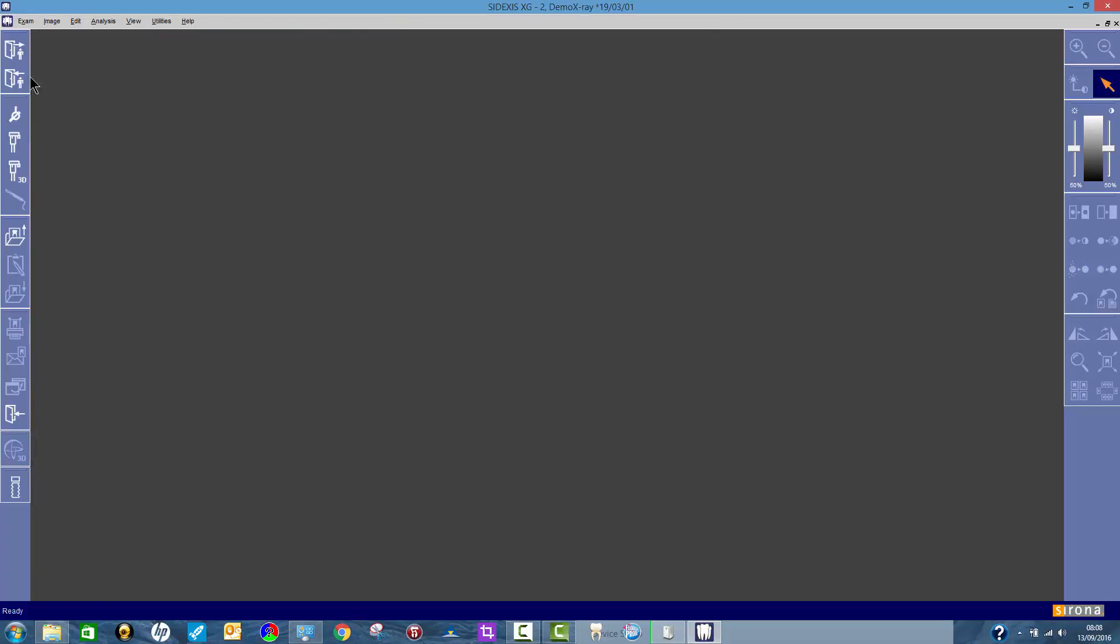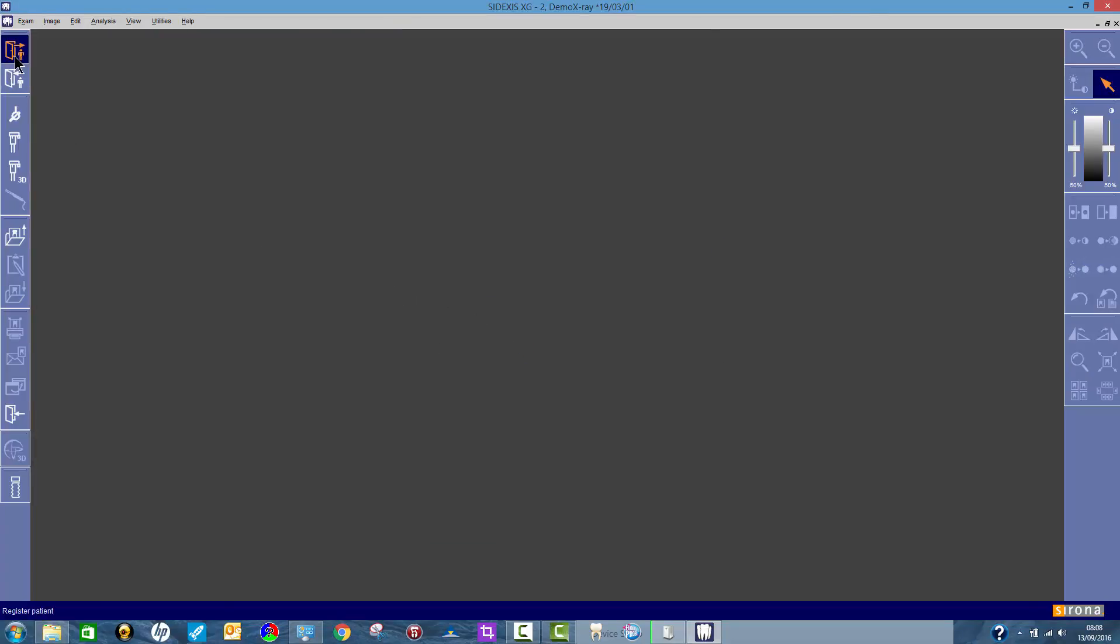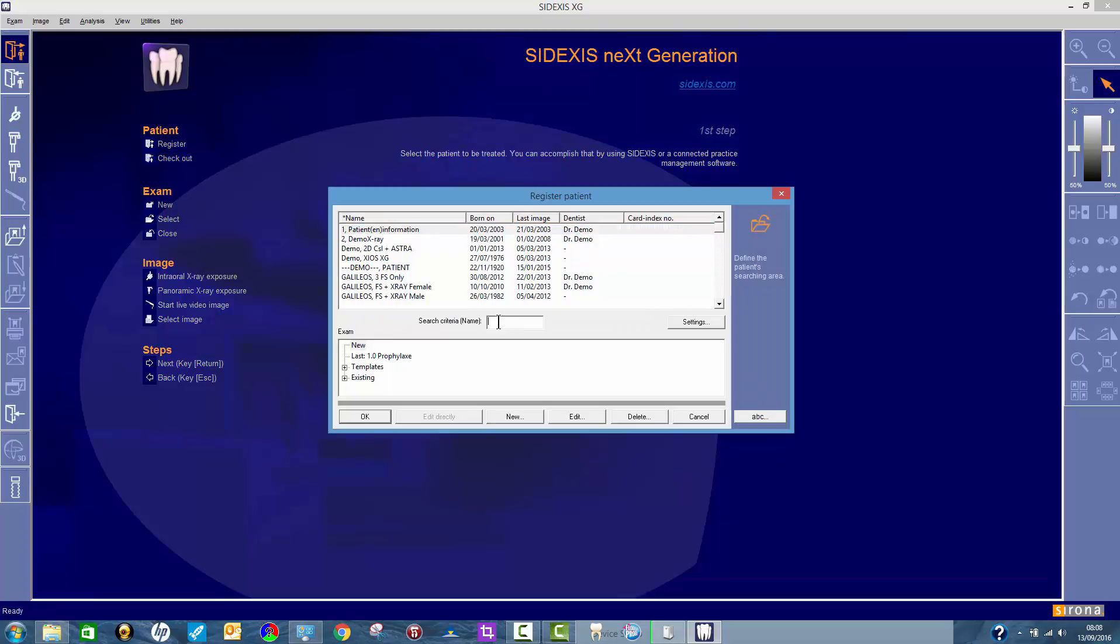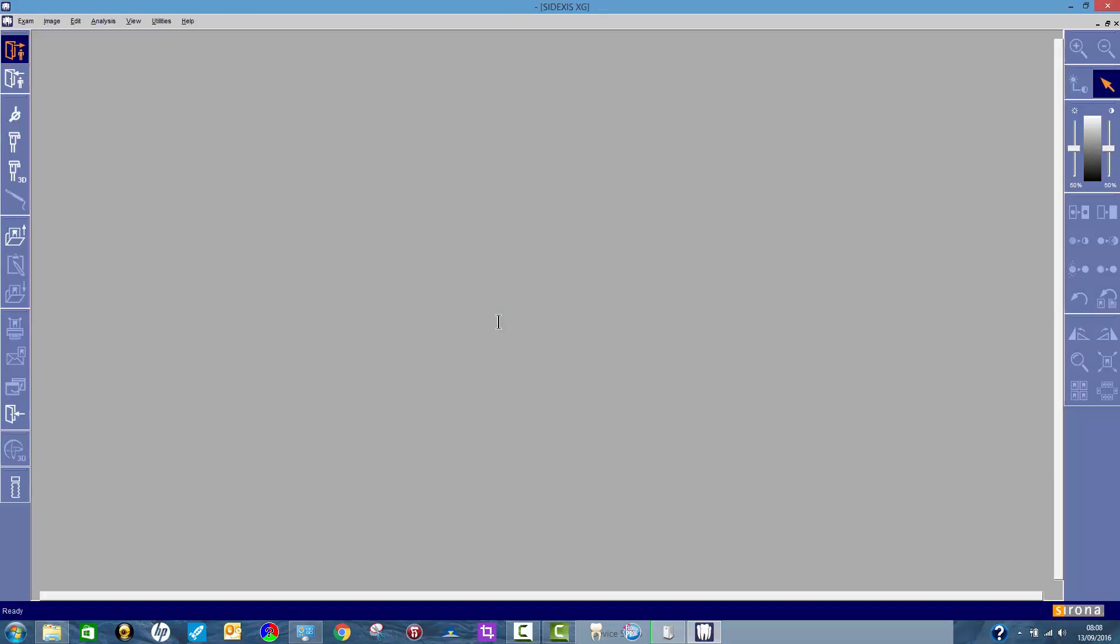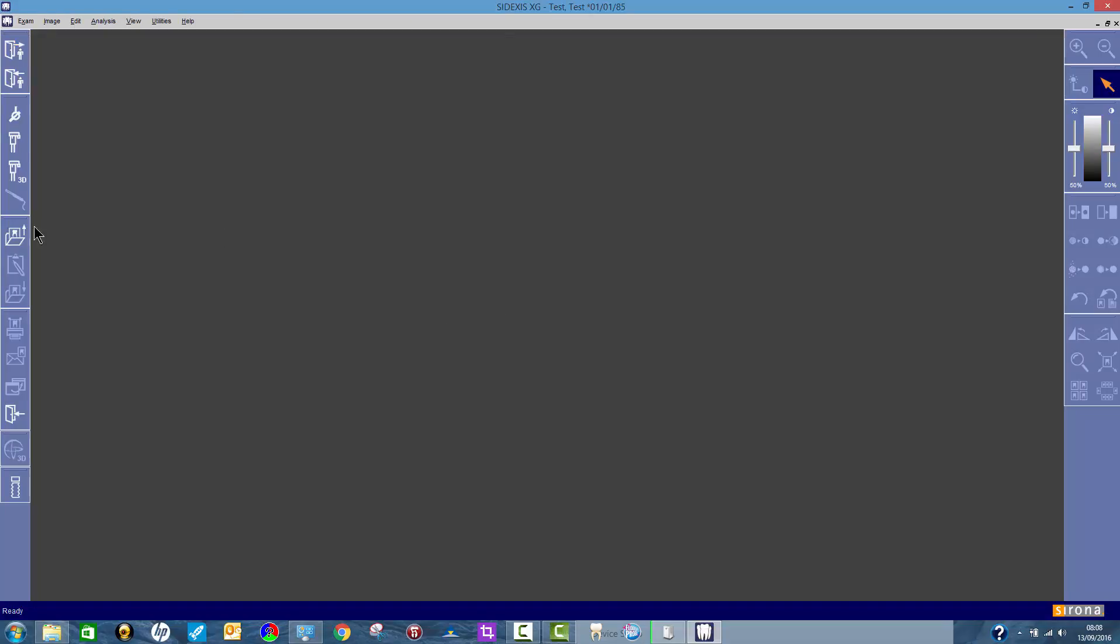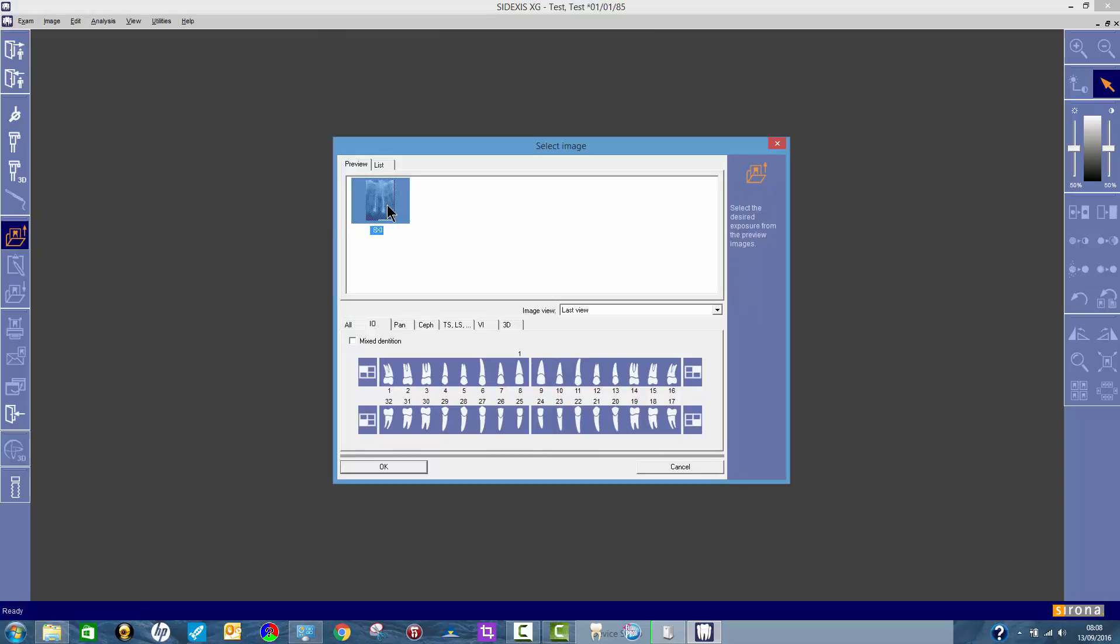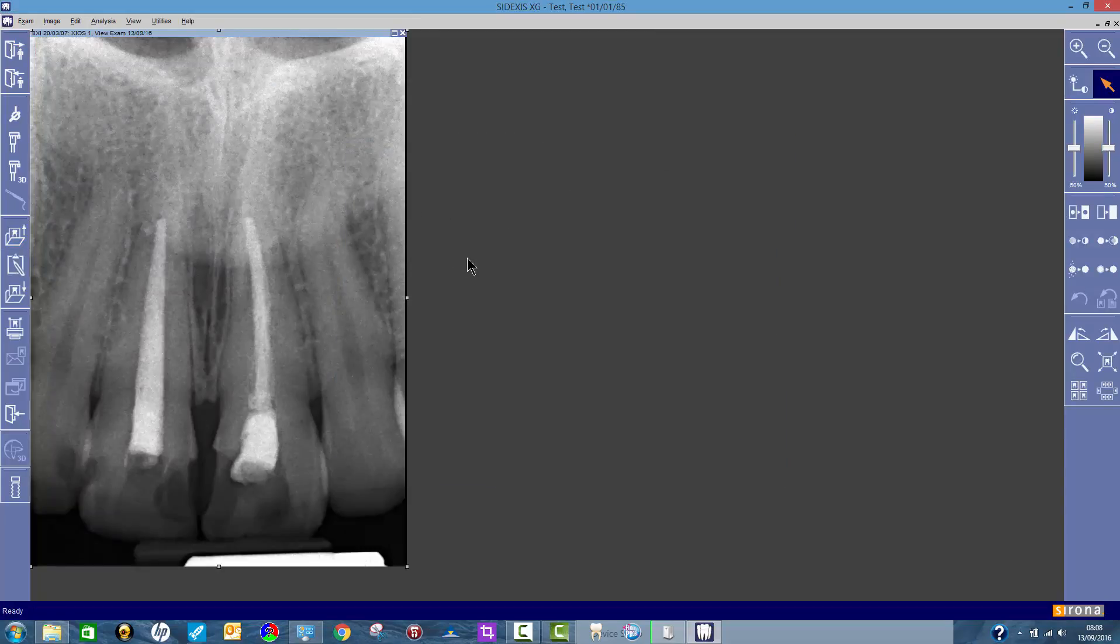So now if I go and find Mr. Test, I will find my image in there. There it is. That's the one I just moved.